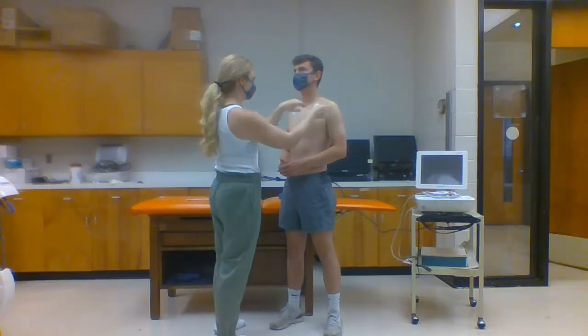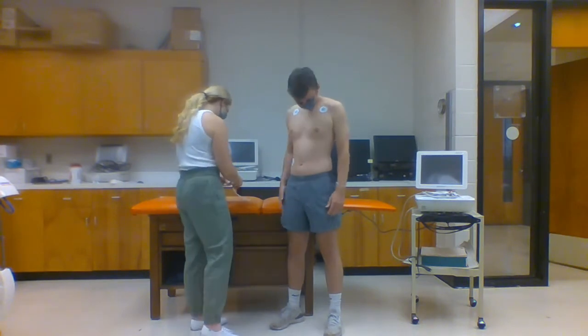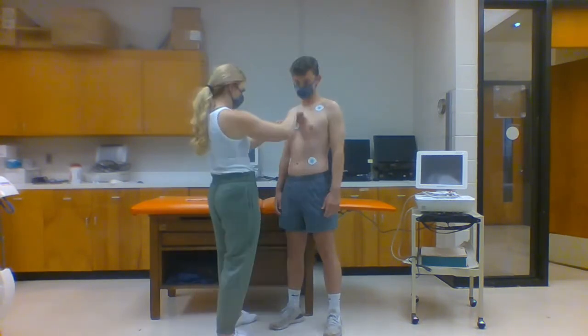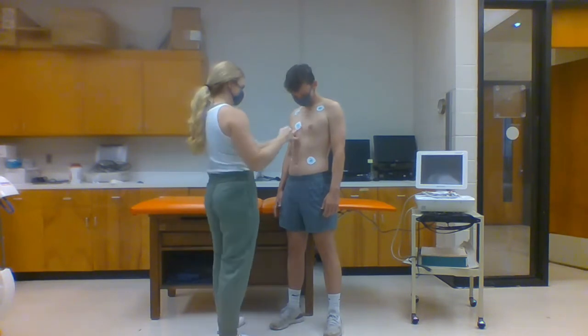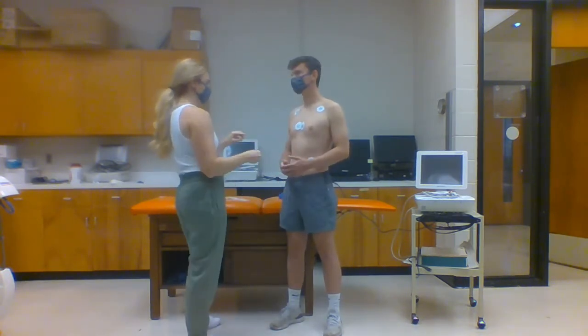If we refer back to the ECG Part 1 lab video, remember the ECG is a non-invasive measurement of the electrical activity of the heart. The ECG will be used today as a modified 12-lead ECG. If you recall from ECG Lab 1, we have 4 limb electrodes and 6 chest electrodes. By using the 10 electrodes strategically placed on the chest, we can view the heart in 12 different ways.